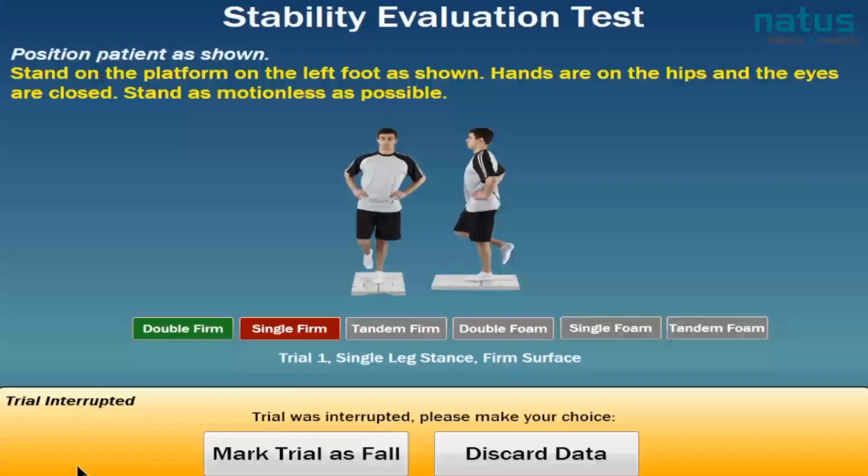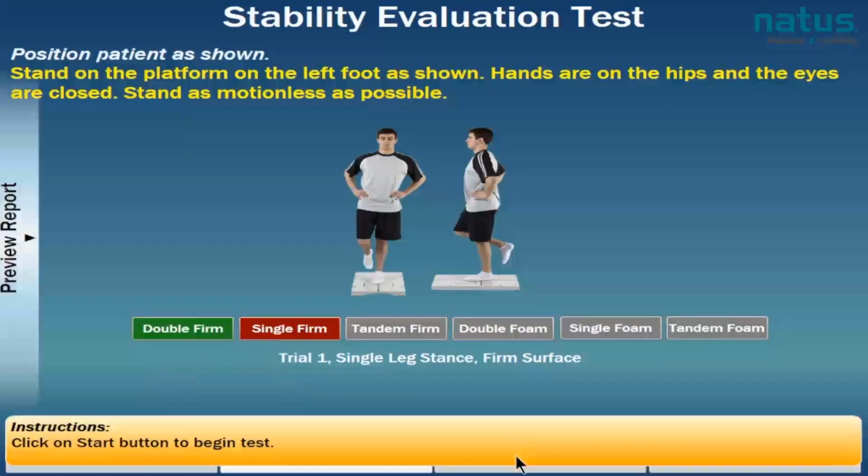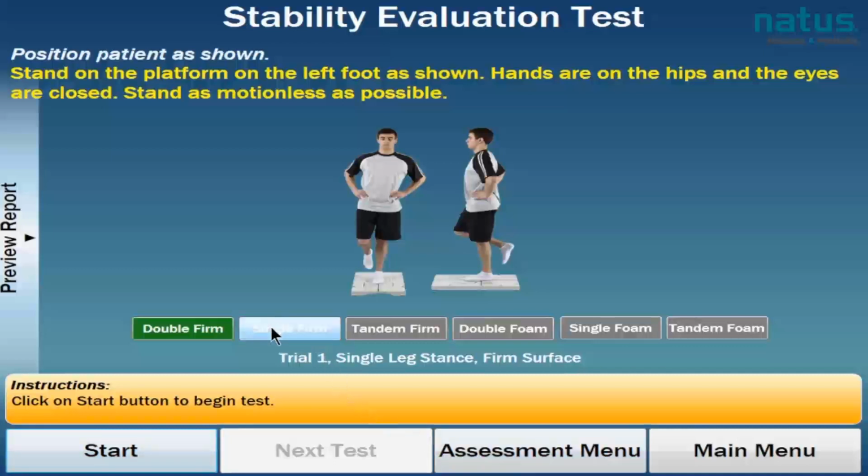It's my job as the operator to make sure that I am inputting any of those balance problems and stopping the test. Here I have the option to mark the trial as a fall or to discard the data. I am going to discard the data for this one and have him try it one more time. I click on the discard data button, and when he's ready, I'll start it again.